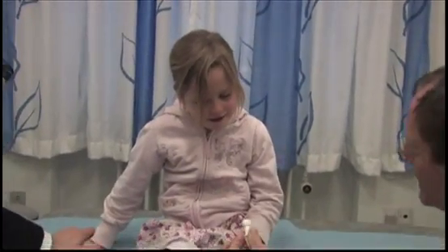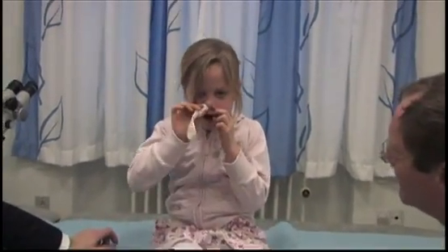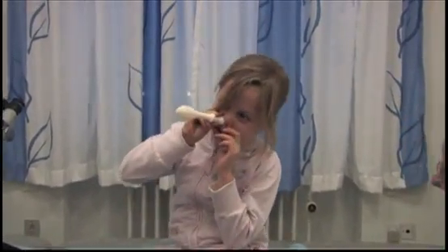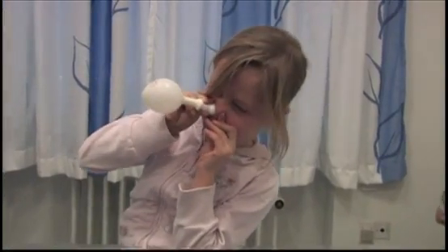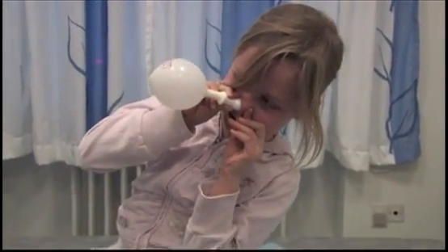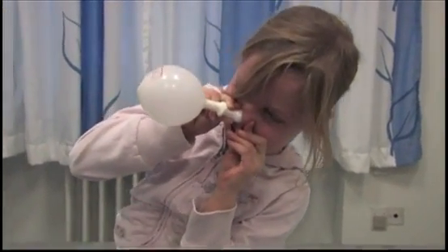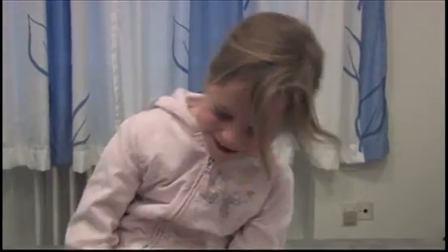Now the child feels confident to try the procedure herself. If the balloon treatment is carried out three times a day for two weeks, the middle ear effusion will be cleared and hearing will be normalized in 50% of children.